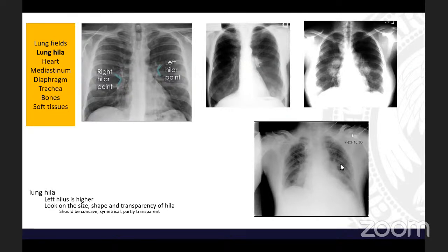On this picture, again, you see big lung hila, but in this case, it's probably because of congestion, because there are vessels in there. But you can see this is really similar. You would need a picture in bigger size to distinguish this. This is more round, and this is more linear, but sometimes it's really hard to distinguish these things. You also need some history of the patient. You need some dynamic of the process, and so on. So it's just big lung hila.